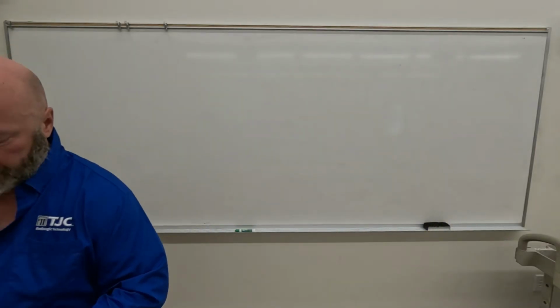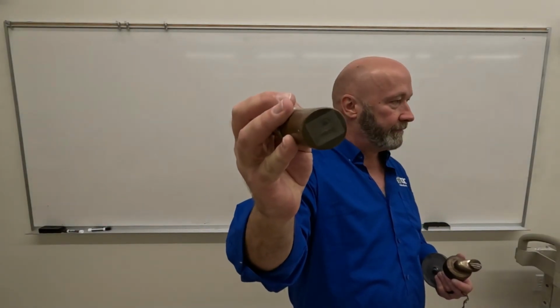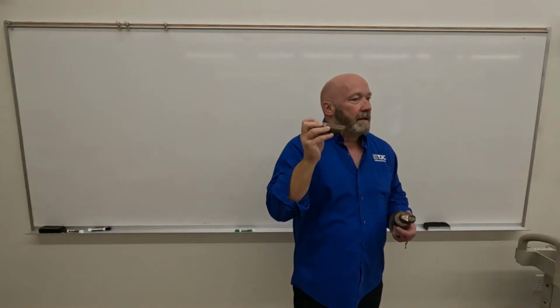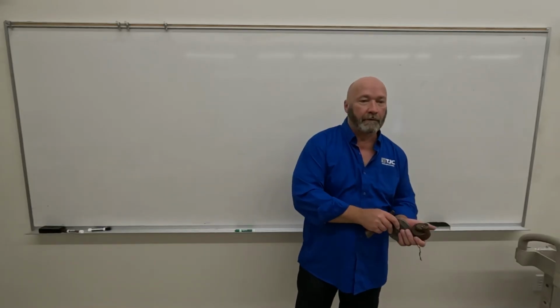So the second anode is also a stationary anode, and you can see the impact point of, this is a little bit more advanced, two separate filaments for large and small focal spots. What we use to control our sharpness or recorded detail, aside from positioning, low OID, and adequate SID, is the size of the filament. So once you get the cathode into the X-ray tube, that's what you're looking at: filament size, large and small focal spot. Small focal spot for sharpness or recorded detail, large focal spot for large exposures. So there's that one.